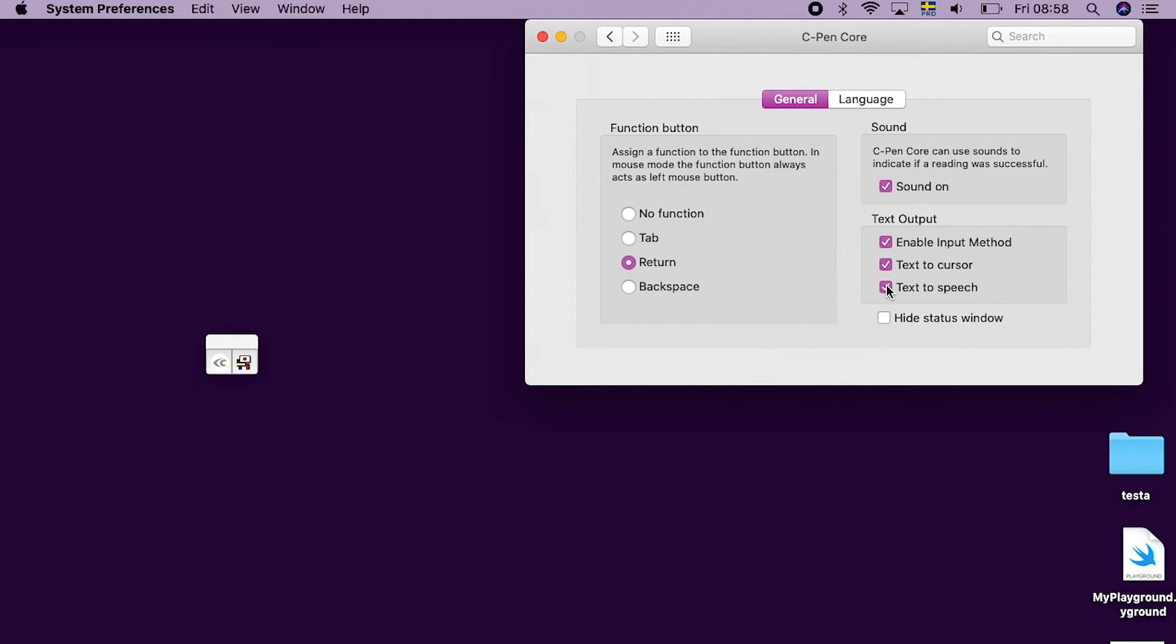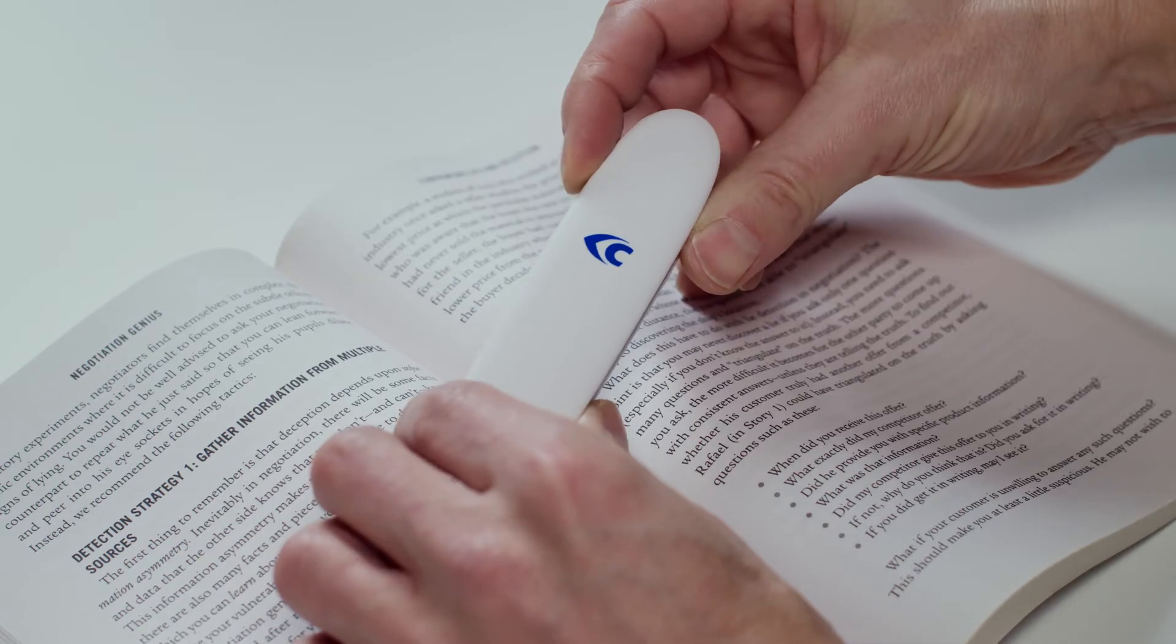If checking the Text to Speech checkbox, the scanned text is also read out aloud automatically for each scan.